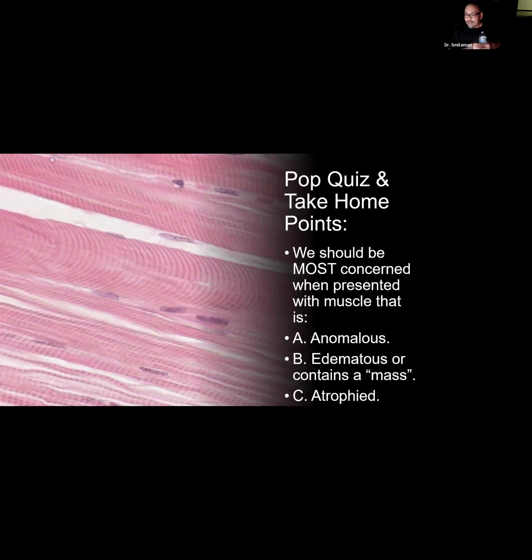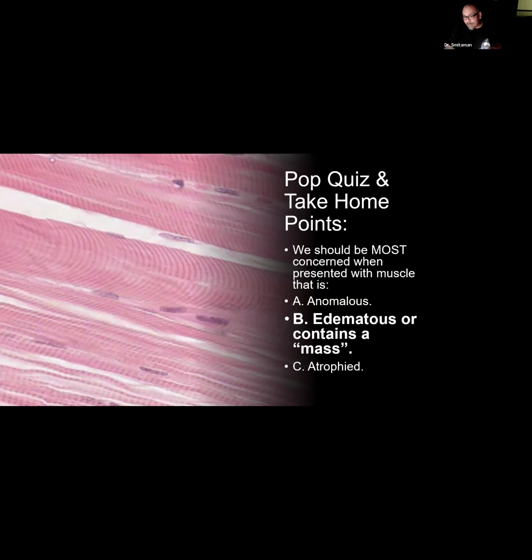B, thank you. Thank you, Dr. Acevedo and others. Yeah, so when it's edematous or mass, when it's anomalous, obviously you don't need to biopsy that. Just give the patient a hug, tell the clinician it's okay. We can follow it at the most. Atrophy, things are typically far gone by then.